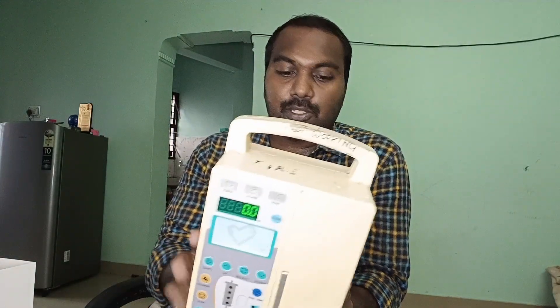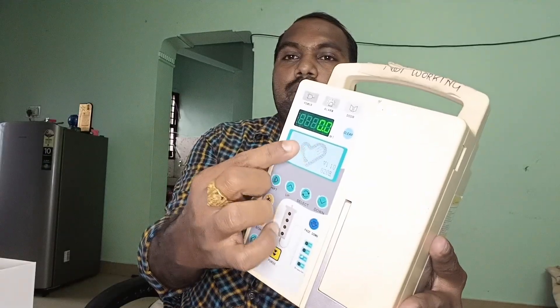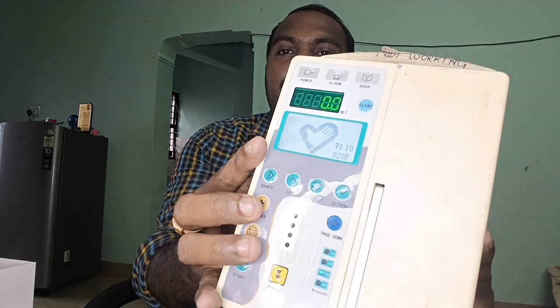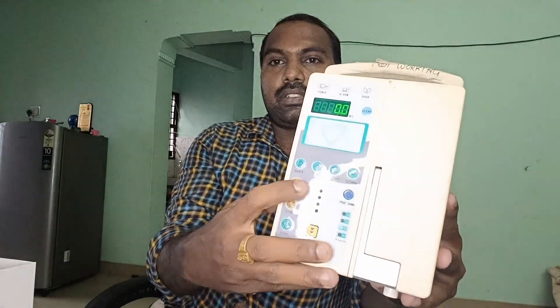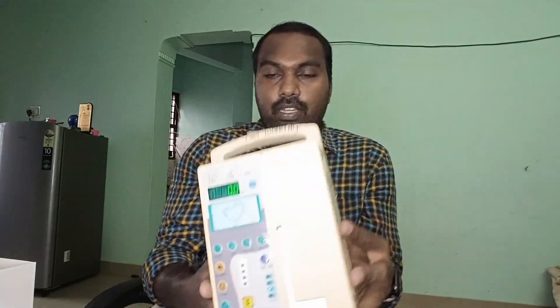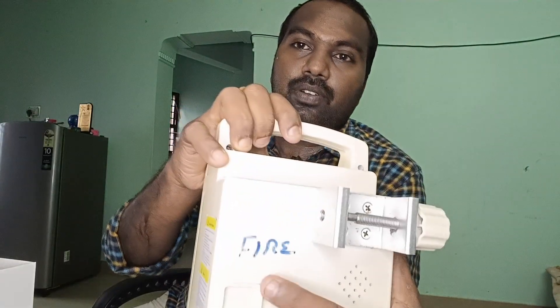Here we have an infusion pump which came in for being stuck at the main screen. As you can see, it's switching on but stuck on the start screen, and the buttons are not responding. We'll open the machine and see what's inside and what's causing this issue. The customer wrote 'fire' on this machine and mentioned it's not working, so let's open it up and hope for the best.